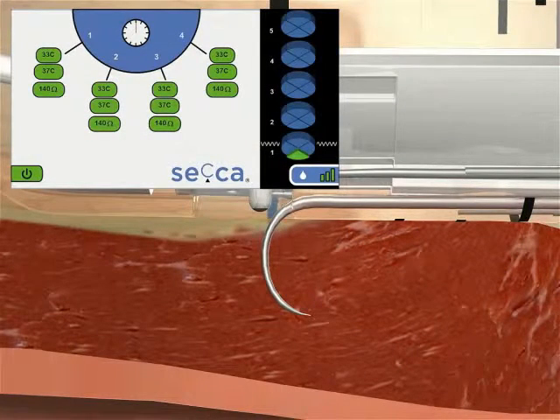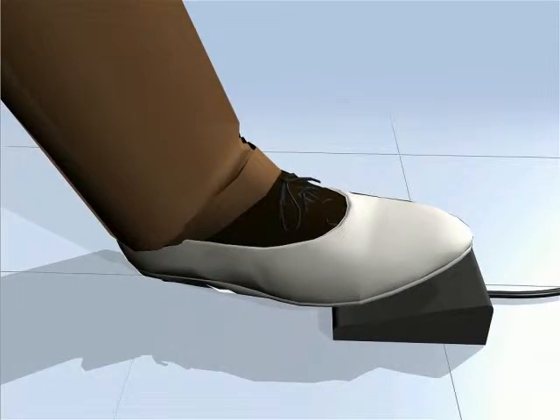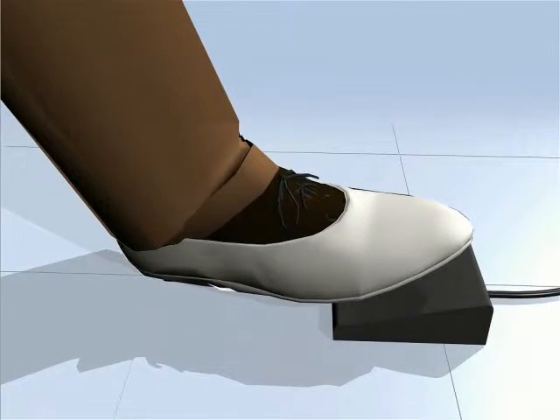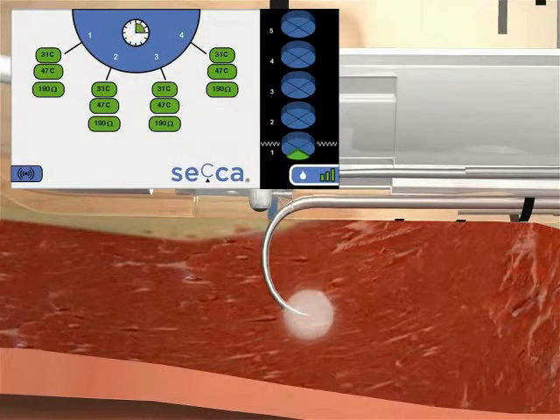Prior to initiating treatment, observe temperatures and impedance. If necessary, retract the needles and reposition the SACA until optimal impedance readings are achieved. In particular, optimal impedance under 200 ohms will result in a better and safer treatment cycle. Press the foot pedal to initiate RF energy delivery. Monitor temperatures and impedance and adjust if necessary.